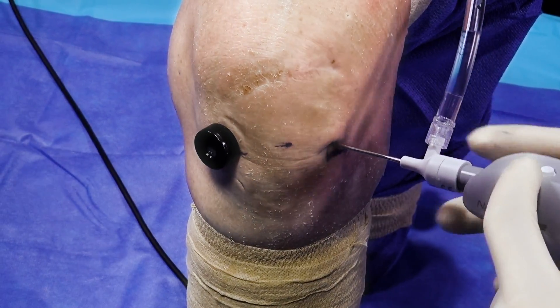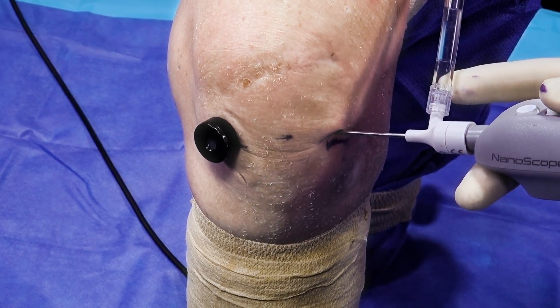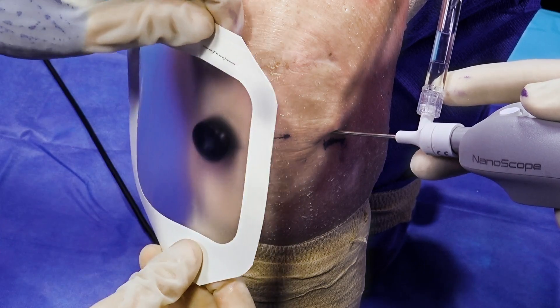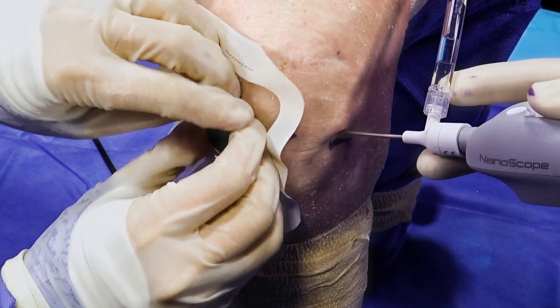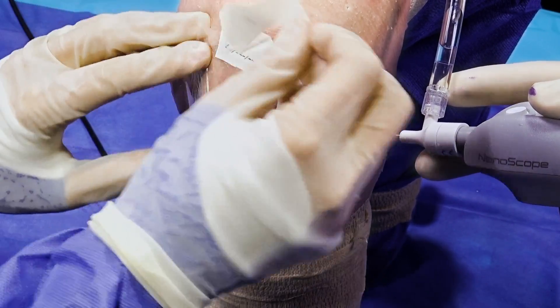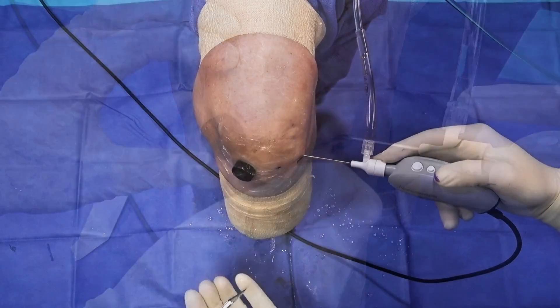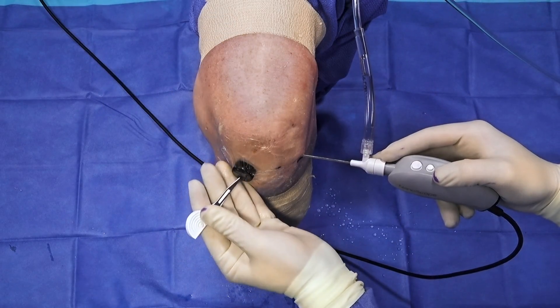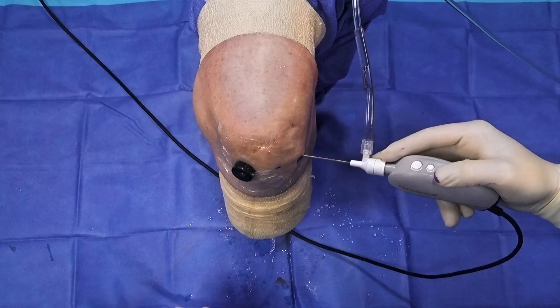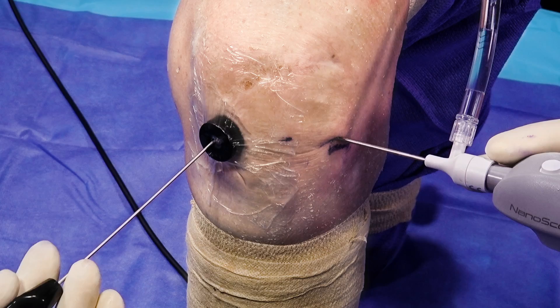To prevent cannula fallout, we will utilize the adhesive Tegaderm, which will really allow our cannula to stay in place. The Tegaderm is placed over the cannula and into the surrounding skin and secured. At this point, we'll make a small incision within the Tegaderm itself to allow our instruments to work through. Amazingly, the only incision you make with this product is through the Tegaderm, not the skin.